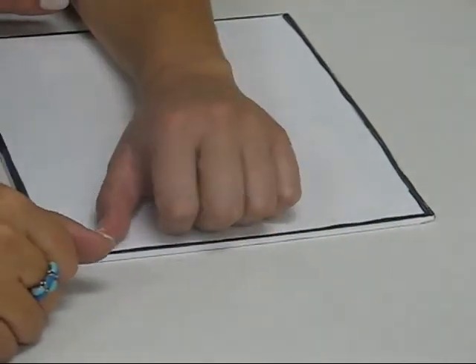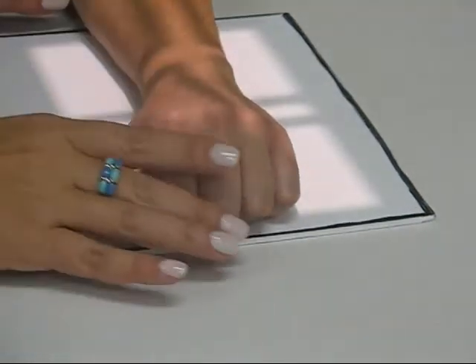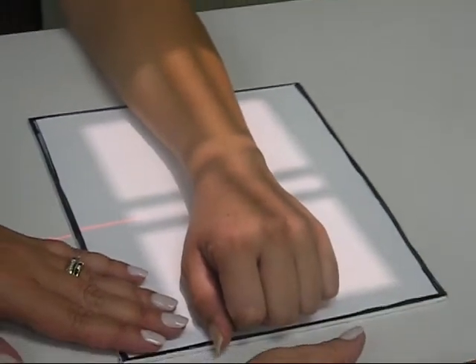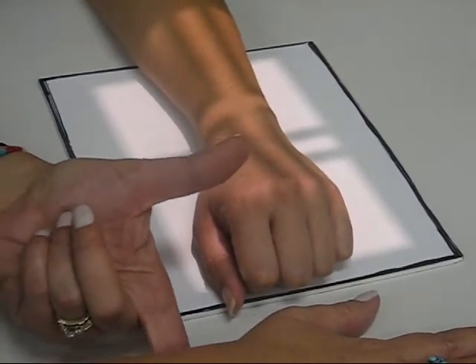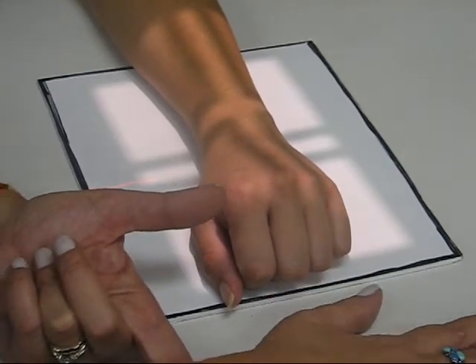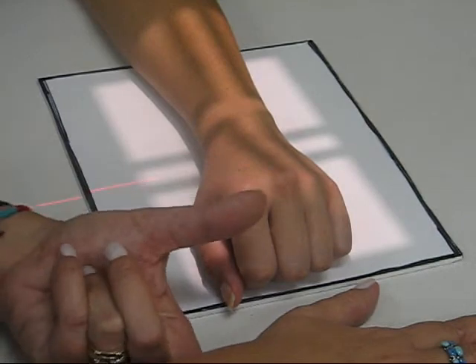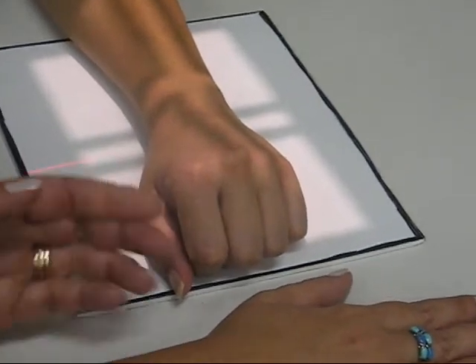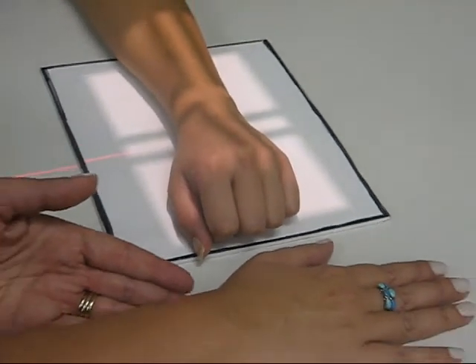Make a fist. The reason why you have your patient make a fist is because when you put your hand down flat, there is a little space due to the anatomical way of the hand and wrist. There's a little space you can almost put your finger through, which means that your wrist is not 100% in contact with the image receptor.